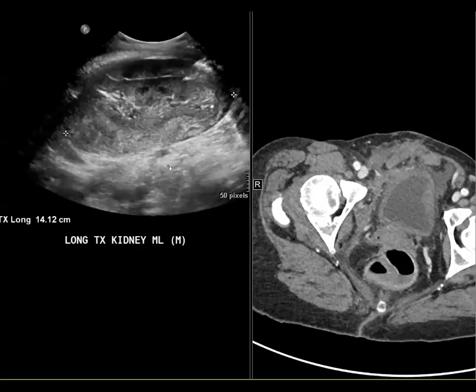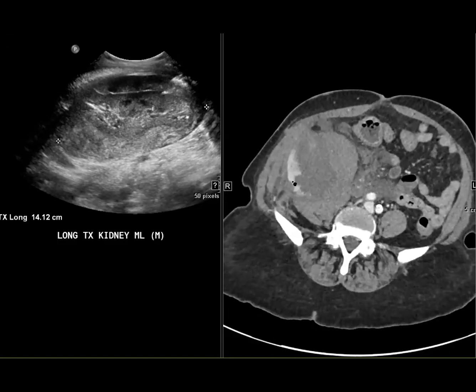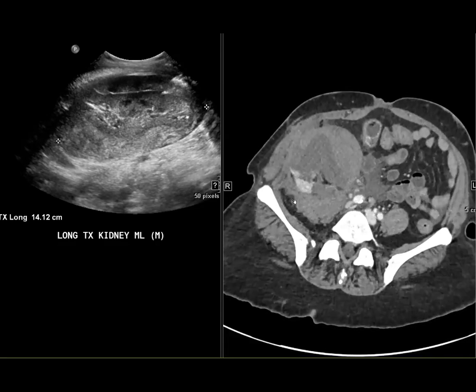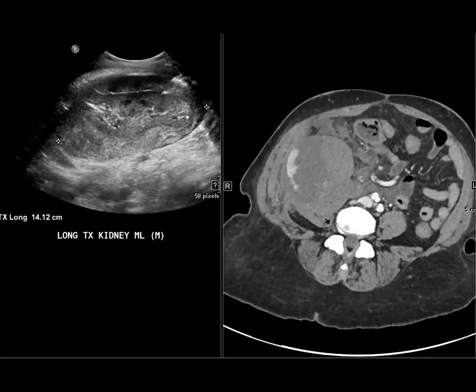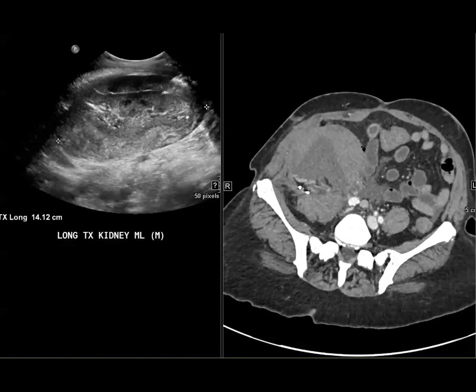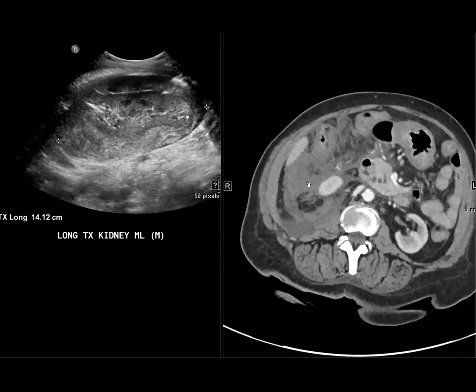So looking closer into the history, this was months after renal transplant, and the transplant wasn't working well. They had undergone a biopsy, and that had led to this large hemorrhage. So we then did a multiphasic CT, and you can see that there was active extravasation, and the patient went to embolization with IR. A couple of other things that I learned about this: they did present with hypertension. And so we were calling this a Page kidney, Rupa saying Page kidney, excellent, and wondering about Page kidney and transplants. You can actually see that a lot of the hemorrhage was subcapsular and contained around the kidney, but also extending into the retroperitoneum and into the abdomen.